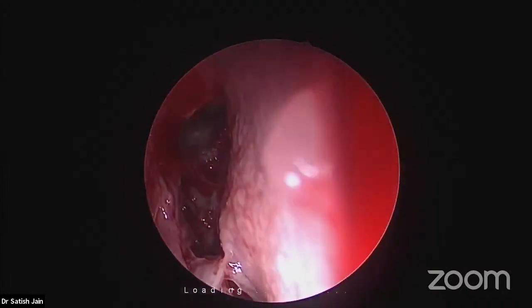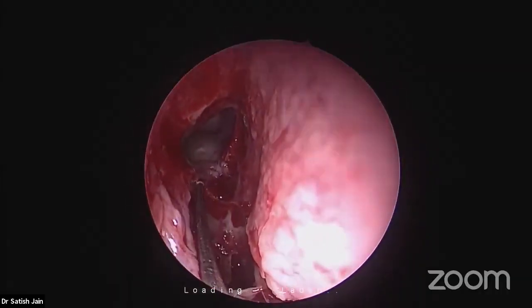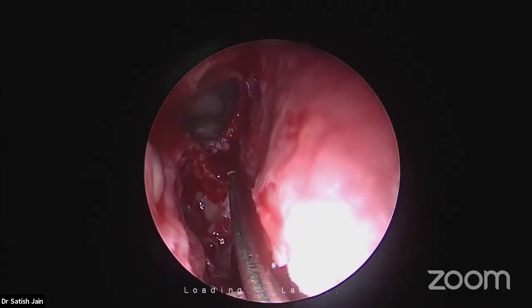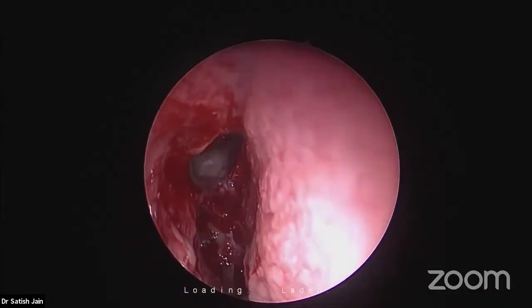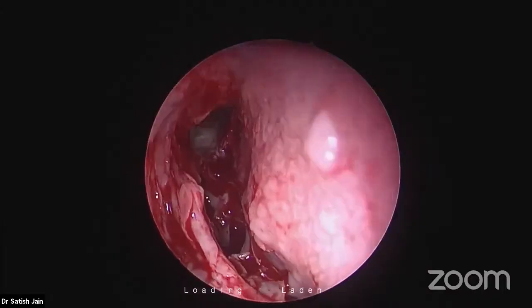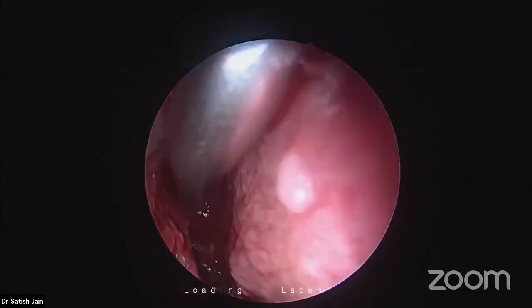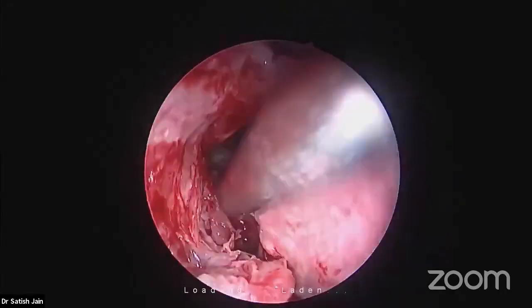See this. This bulla, which was coming over here, was going on to the skull base, where this was the attachment of the bulla. See this septa which I have broken? This was the attachment of the bulla and the artery was behind that, protected. And this small recess is the suprabullar recess. What you see above is the roof. I'm using the reverse blade here, the so-called adenoid blade, to remove this tip of the bulla, the anterior part of the bulla, to show you something more.